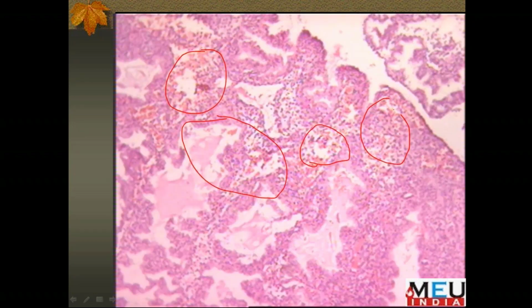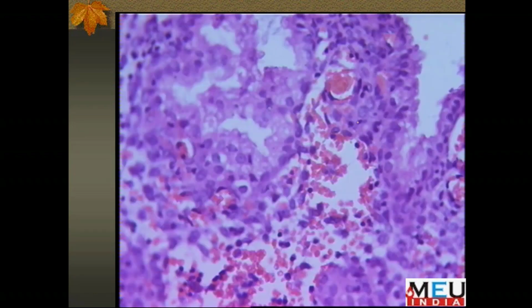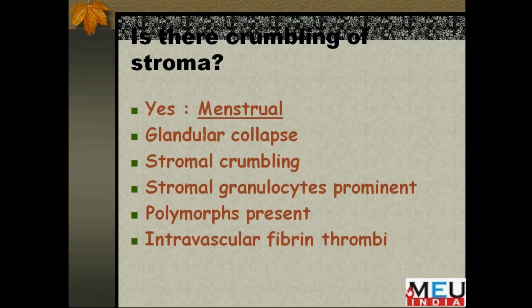Now I'll show you after this the site which I had promised. This is a very good site for understanding normal histology. It is called histologyguide.com, and it has beautiful images. So I'll start with the vagina; I didn't do the vagina, I just started straight away with it here. Now this is the normal vagina.